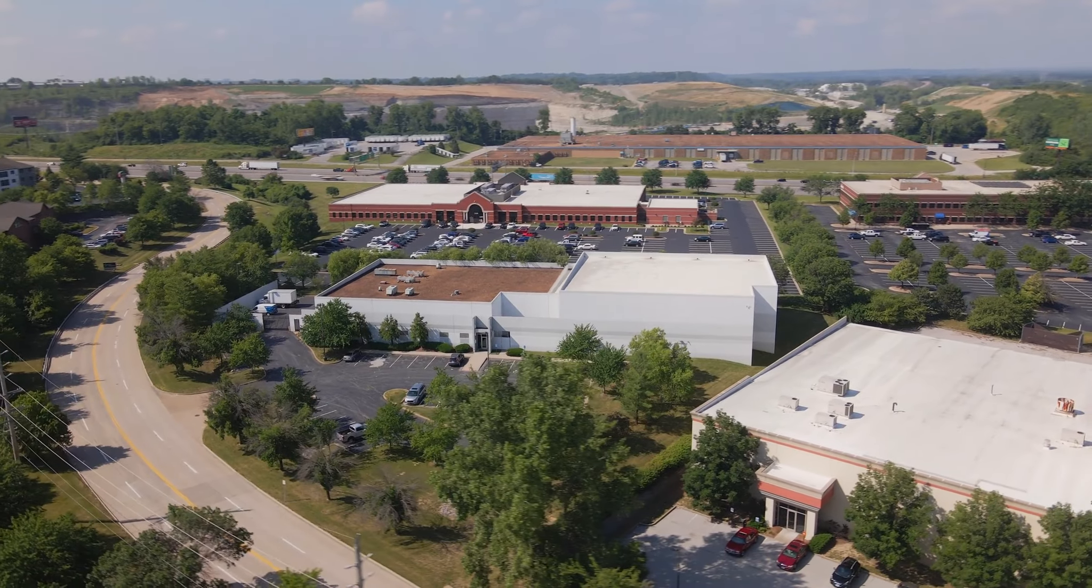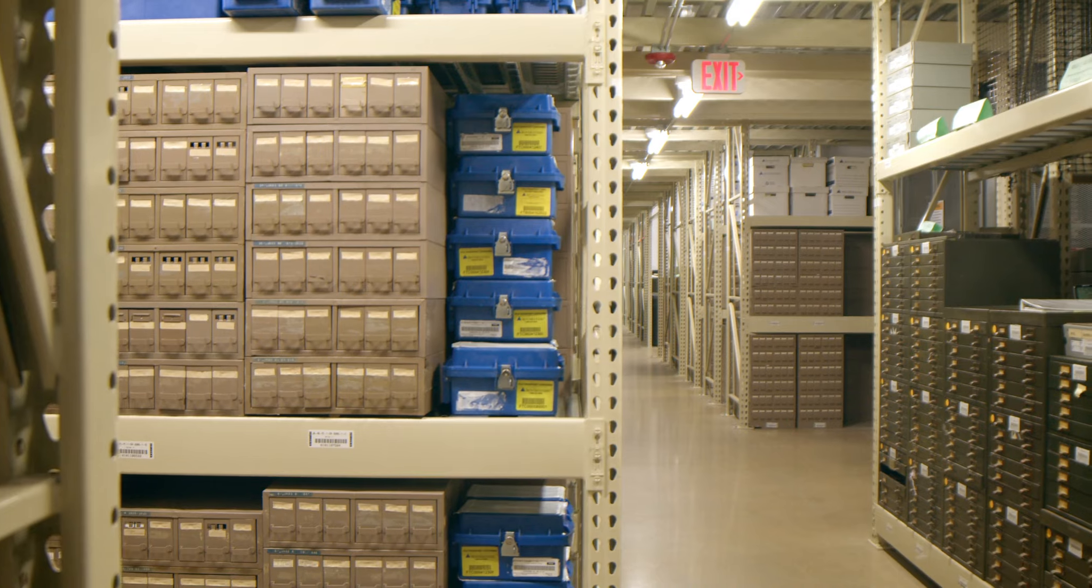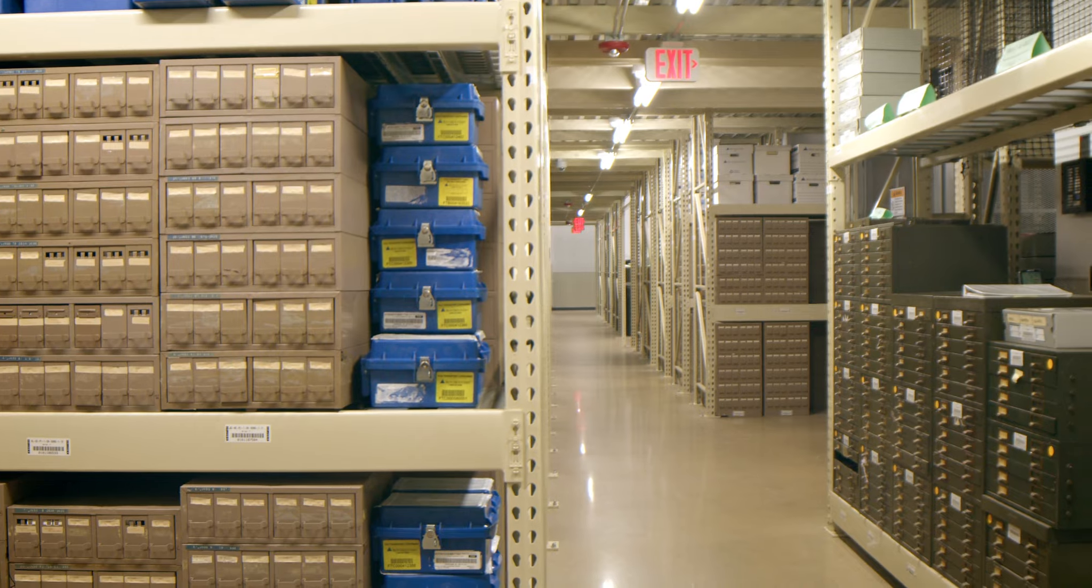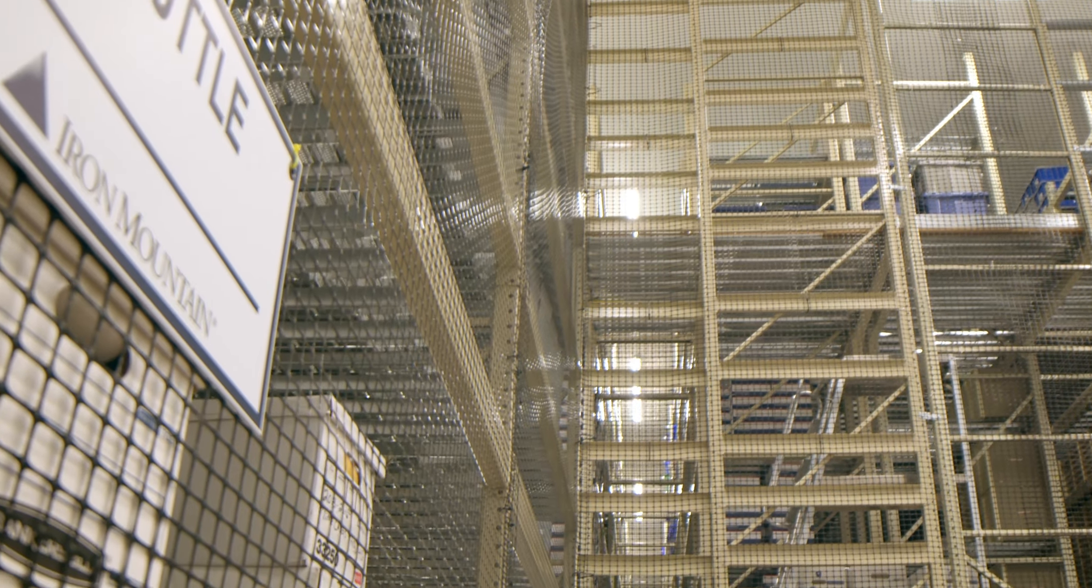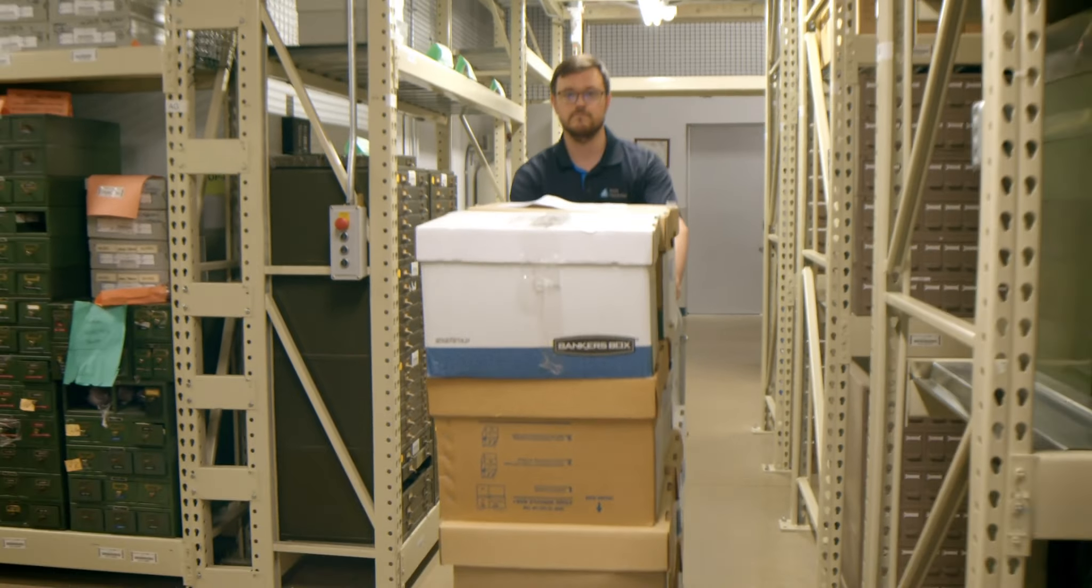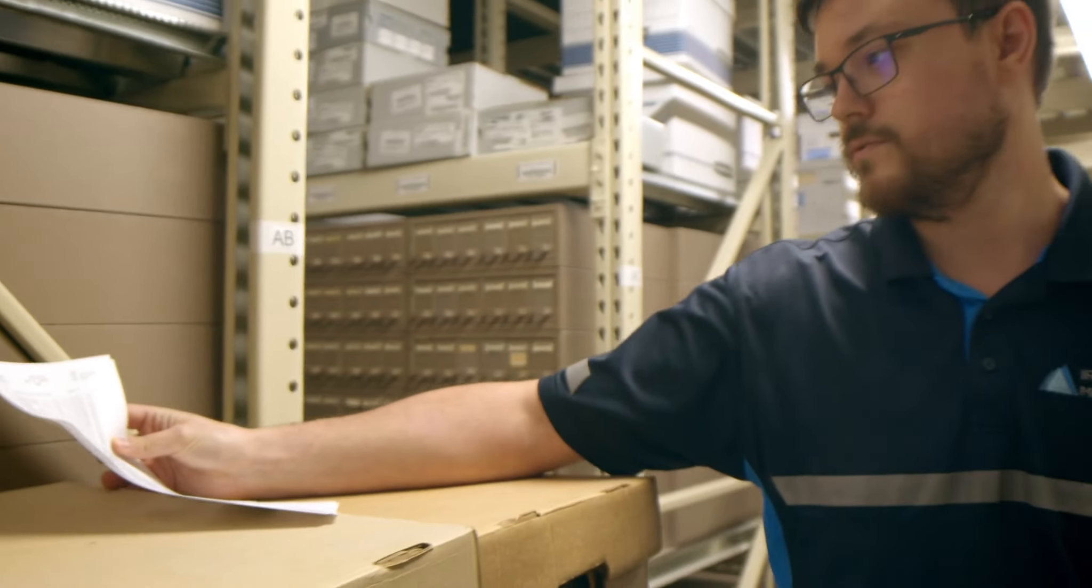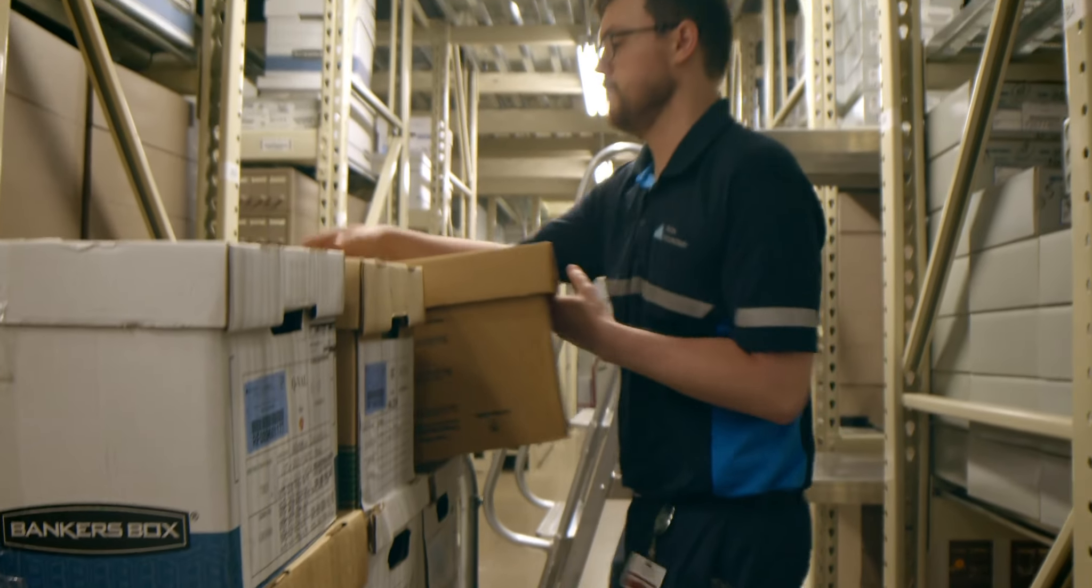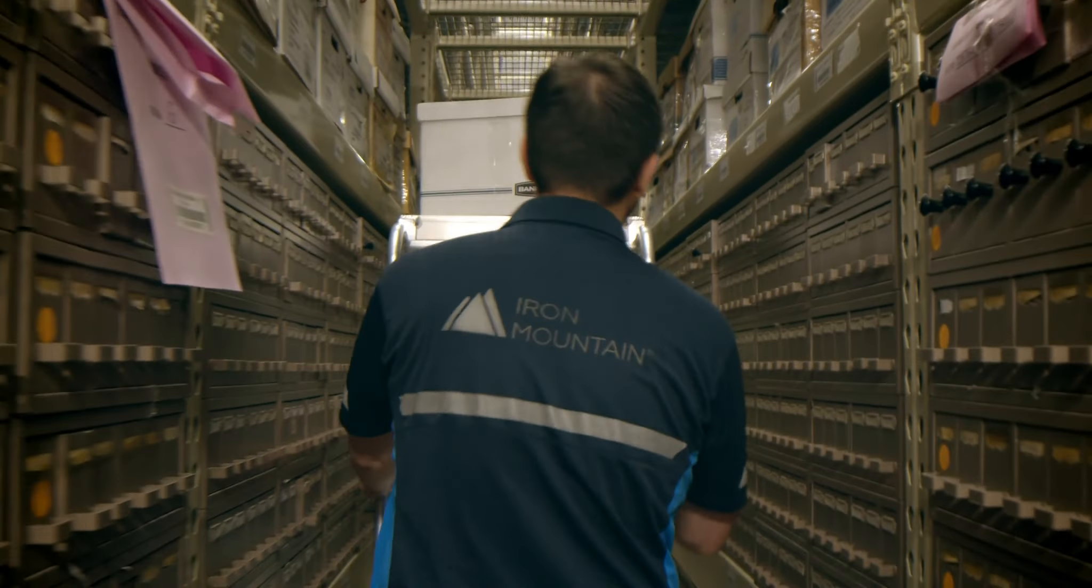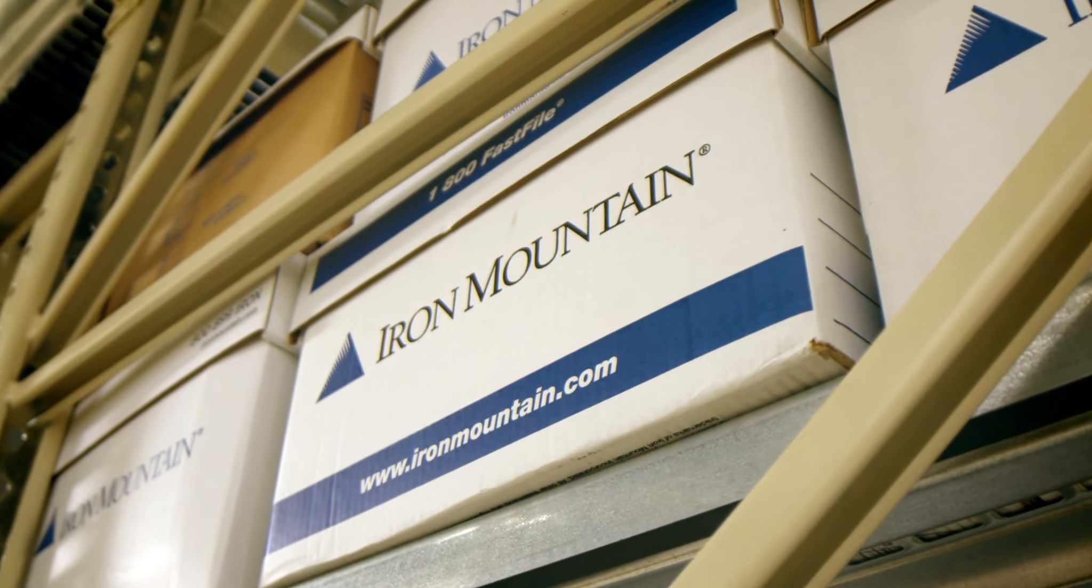Labs today are faced with an ever-growing volume of slides and blocks. As our customers face this storage challenge in their facilities, they trust Iron Mountain to provide scalable storage that is highly secure and compliant. And so they've asked us to provide a similar solution for digital pathology.